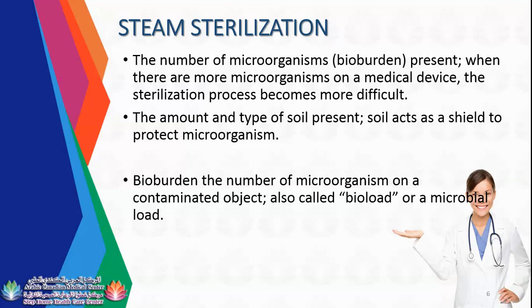Which means you need to do the manual brushing. You need to remove the bioburden of the instruments. You can see some of the images of it in the book, and we will discuss it more later on. That's the reason why you need to do the manual brushing before putting the instruments in the autoclave, before putting the instruments in the ultrasonic machine. You need to remove some of the bioburden, and fine removal is through the ultrasonic machine.